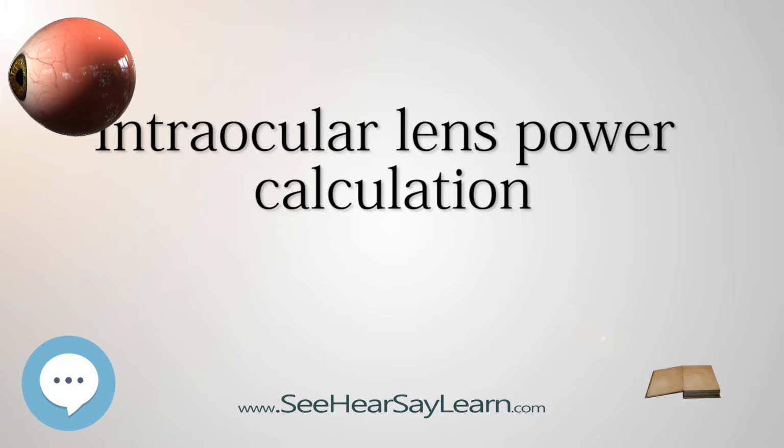The improvements in IOL power calculation are the result of improvements in the predictability of the ELP. The best known modern formulas are SRK/T, Holladay 1, Holladay 2, Hoffer Q and Haigis. These formulas are programmed into the IOLMaster, Lenstar, and most modern ultrasonographic instruments, thus eliminating any need for regression formulas.